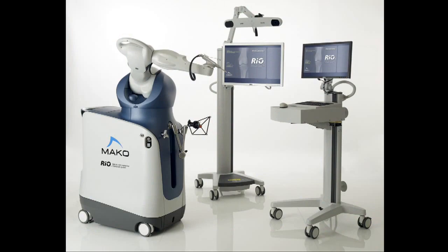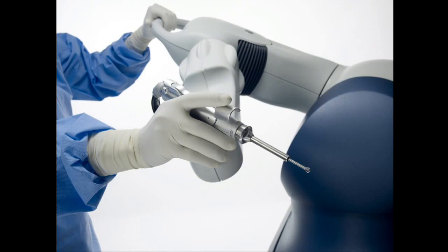So the Makoplasty for the hip is basically a traditional hip replacement done with some newer technology. In particular, we're using computer-guided navigation to help us orient the hip components in the proper position. And then implanting the components is done using the robotic guidance. So the whole idea is to implant the components more precisely, which we think will make them function better. We hope they recover quicker, and long term, we hope that they survive longer and don't have the incidence of failures that we've seen with some of the more traditional hip replacement approaches.